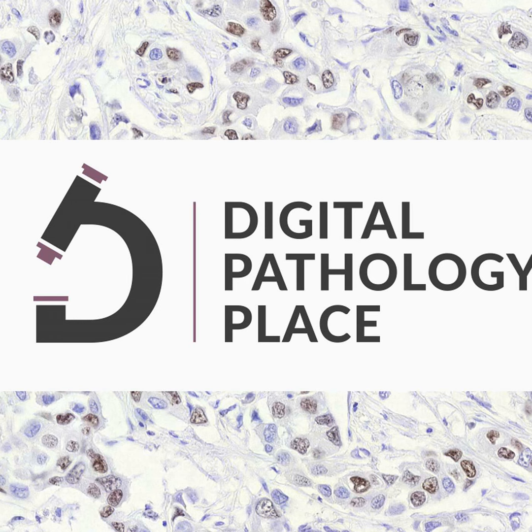So what they ended up doing was not shortening or focusing, or I'll just say curating the diagnosis to what the primary diagnosis was. We all know pathologists are notorious for hedge language, for verbosity, for use of different types of terms. So we know that, right? So what happened was, for lots of the cases, the whole report was just pasted into our database, and then the adjudicators had to sort it out.